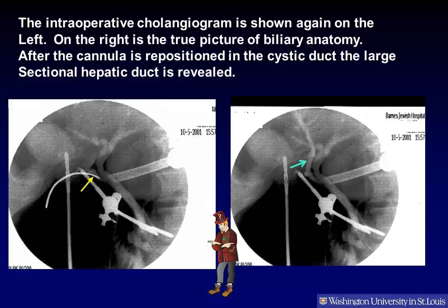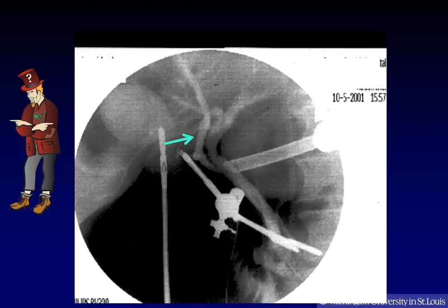The intraoperative cholangiogram is shown again on the left. On the right is the true picture of biliary anatomy. After the cannula is repositioned in the cystic duct, the large sectional hepatic duct is revealed, as shown by the blue arrow. Here is a close-up of the same cholangiogram.